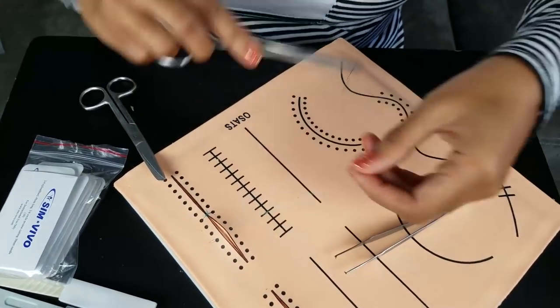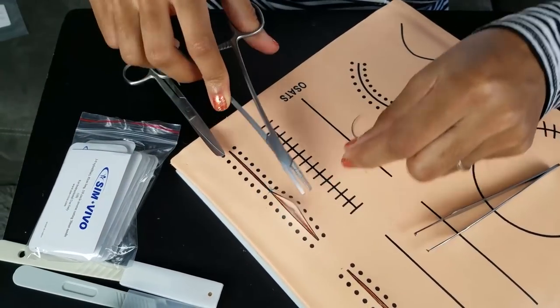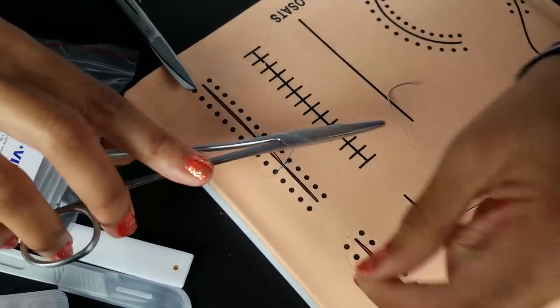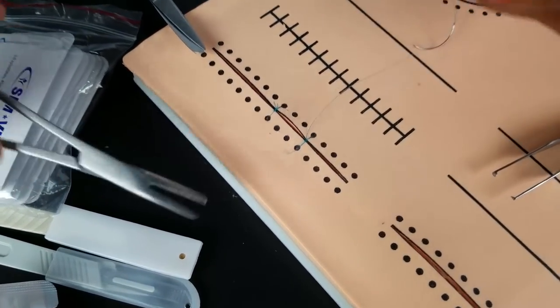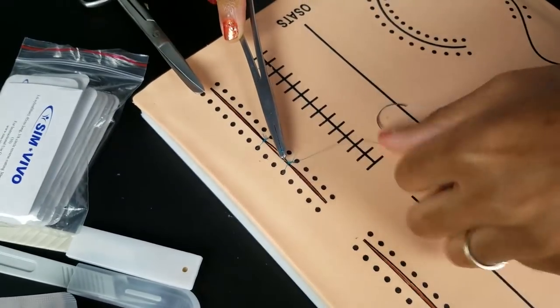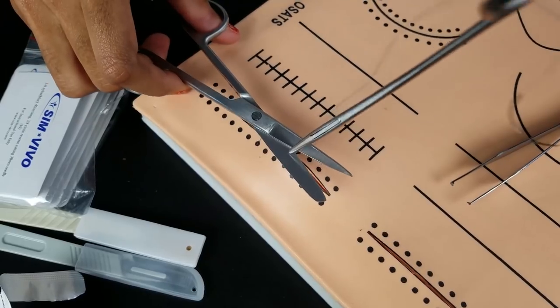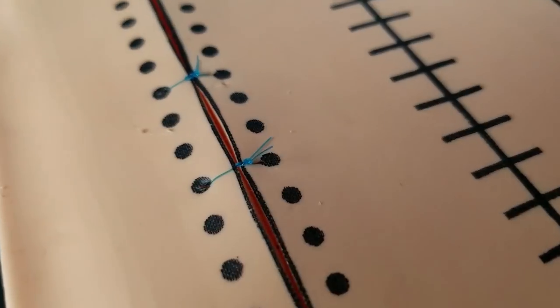Okay, and so then I'll drop my needle down where I know where it is, roll it twice. I think I can actually put a little bit more. There we go. Give a little bit more give with that, yeah. Roll it once, pull it through. And one more time, get that tip, pull it through, pull it tight to the other side, and then just clip it off. Where am I? There we go. I think I'm getting the hang of this.